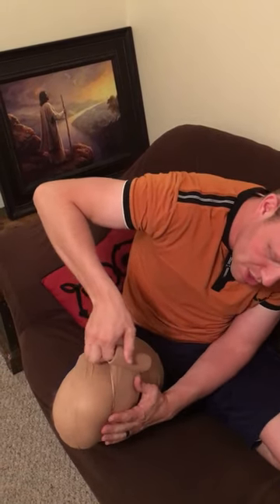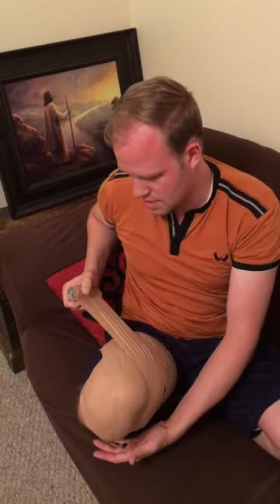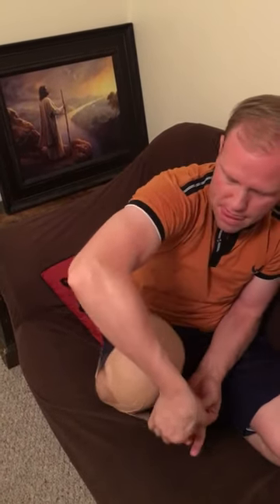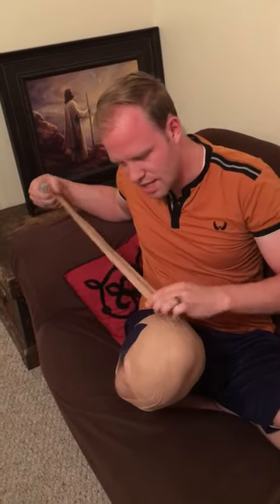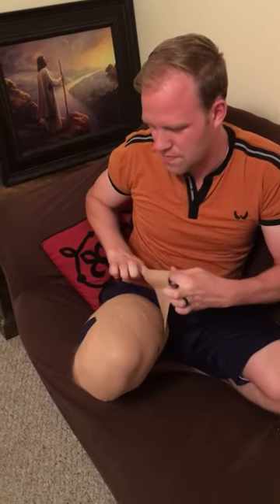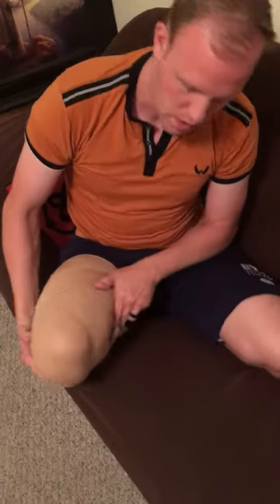I've got a fat leg so it's a little bit challenging. We want to just make sure there's no skin showing. Oh dang it, this thing gets stuck on itself, unlike an ace bandage which does not get stuck on itself. And there you go, that is a wrapped stump.